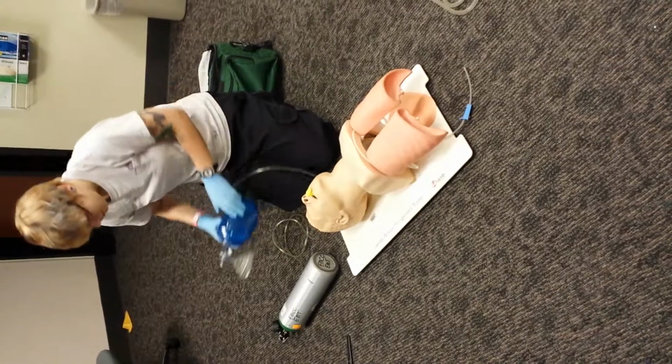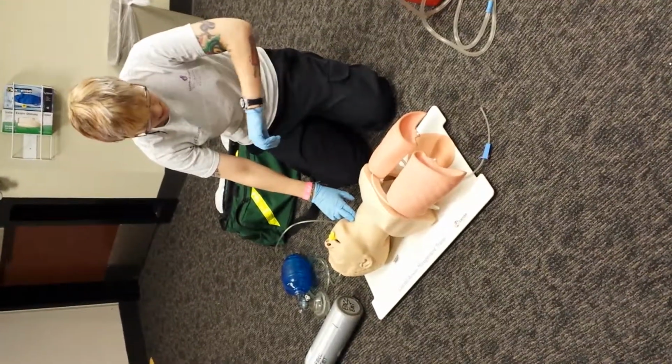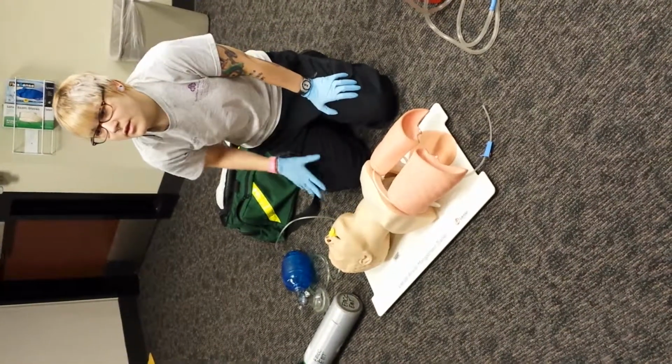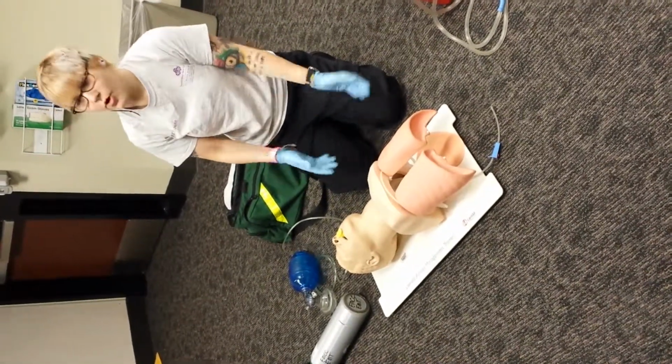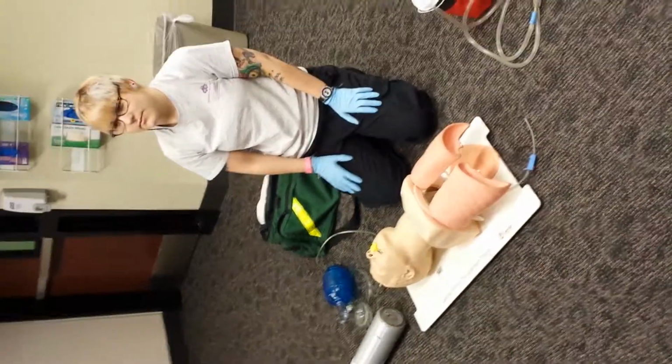I'm going to check his carotid pulse. How would you know that you are delivering appropriate volumes with each ventilation? The rise and fall of his chest. And that concludes BVM ventilation of an apneic adult patient.